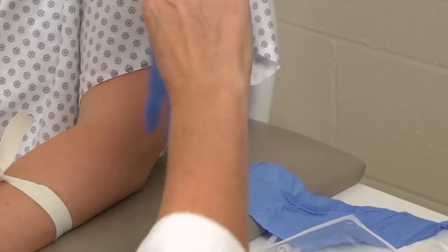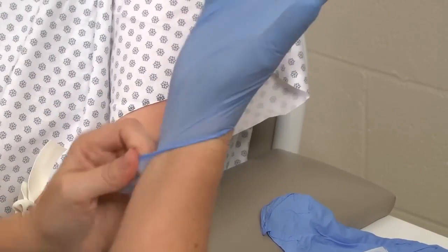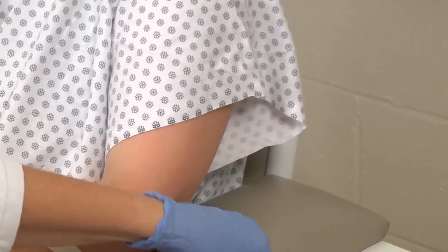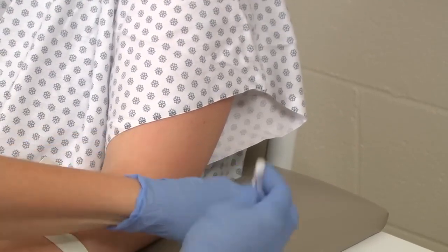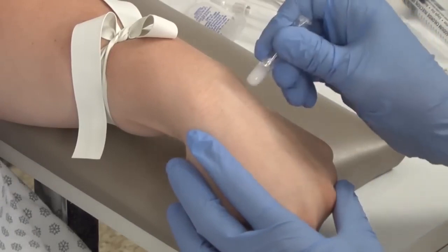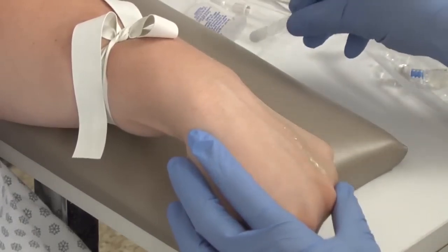Put on the non-sterile gloves, making sure they are latex-free if needed. Once you are gloved, activate your cleaning solution. Often this is done by squeezing or cracking the container. Cleanse the site in the direction of the vein and dry as needed.